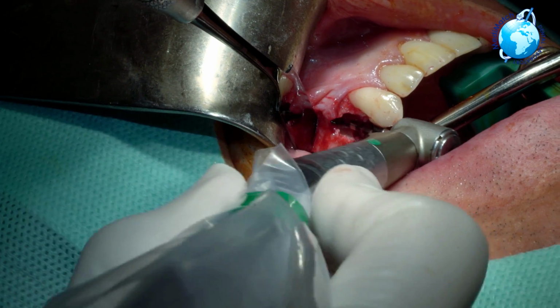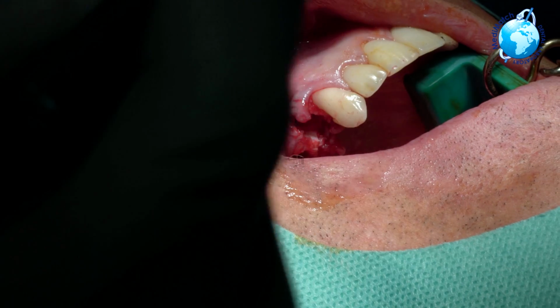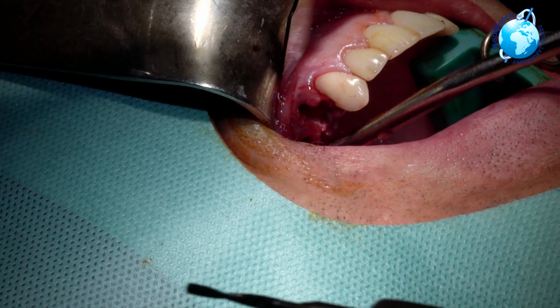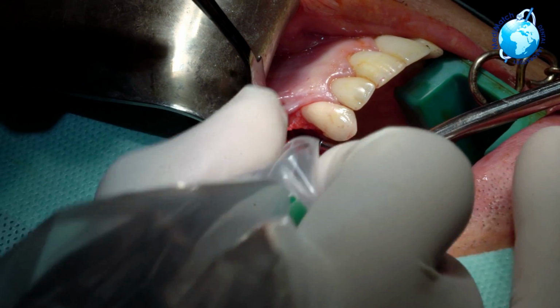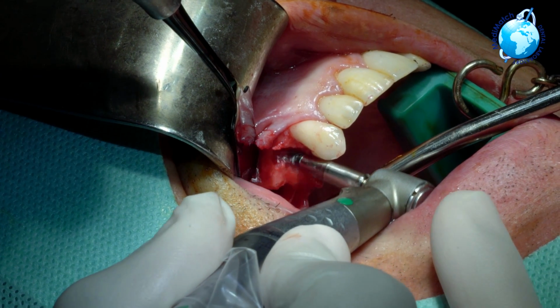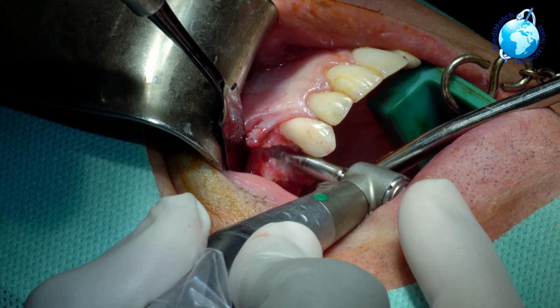A common issue with a long canine: you need to get deeper, you're knocking the tooth, yeah? So what you need to do is get back on that drill extender, get the patient opening wide enough to get away and into the position that we want this implant. Open again, Alan. They really stretch you for a minute, okay? Try to get in the socket position where we want to position, yeah? Check that all out. Amazing. And then we're going to countersink a little bit more.